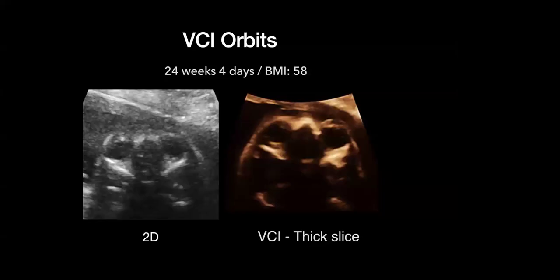Here's an example of a 24-week, 4-day fetus, with a BMI of 58. Here you could see the orbits. I would say they are pretty decent and clear in 2D grayscale imaging. However, when you turn on VCI thick slice, you could really appreciate those bony structures.